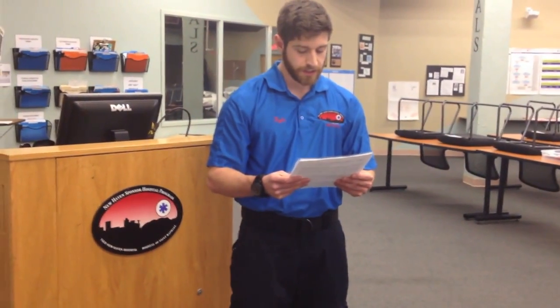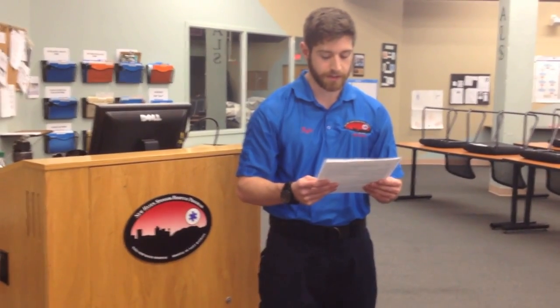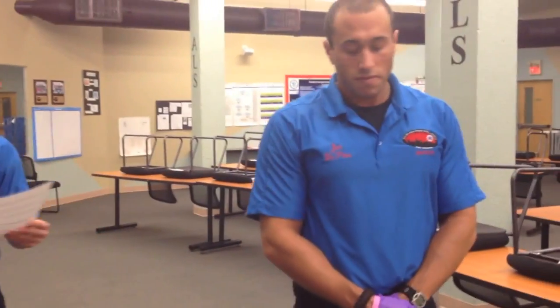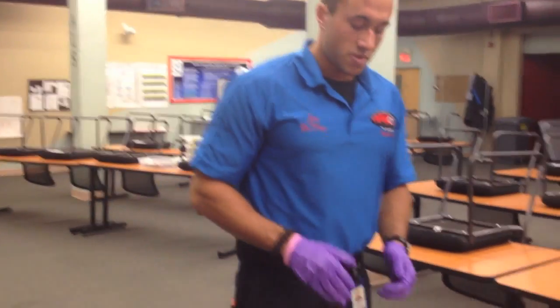Upon your arrival to the scene, you find a patient lying motionless on the floor. Bystanders tell you that the patient suddenly became unresponsive. The scene is safe and no hemorrhage or other immediate problem is found. You have five minutes to complete this skill. The scene was confirmed safe and I have my proper BSI on. I'm going to walk up to the patient and check for responsiveness.